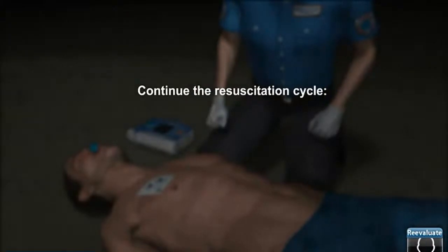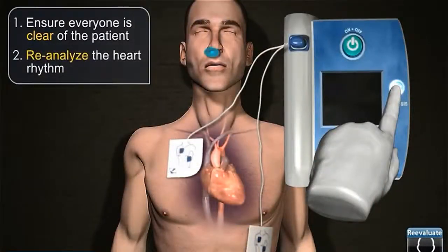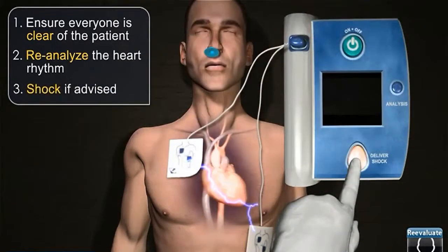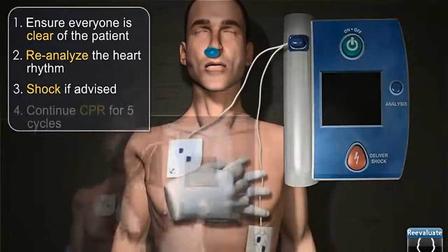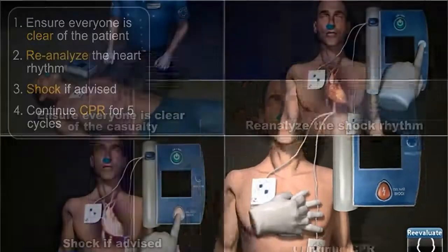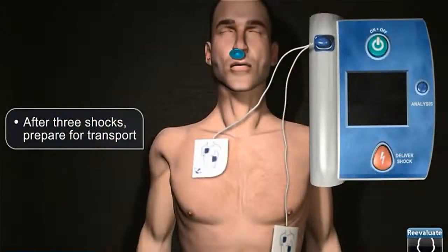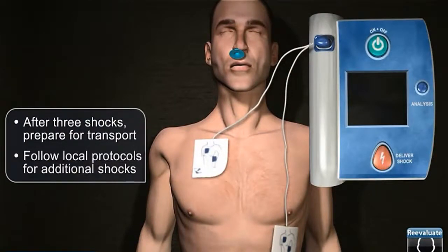Continue the resuscitation cycle. Ensure that everyone is clear of the patient. Reanalyze the heart rhythm. Shock if advised, and continue CPR for 5 cycles. After 3 shocks, prepare for transport. Follow local protocols for additional shocks.